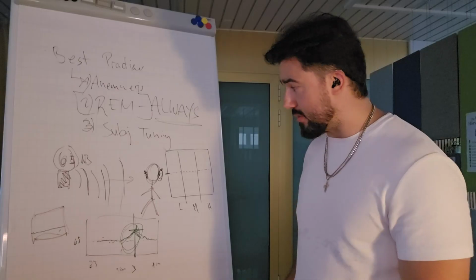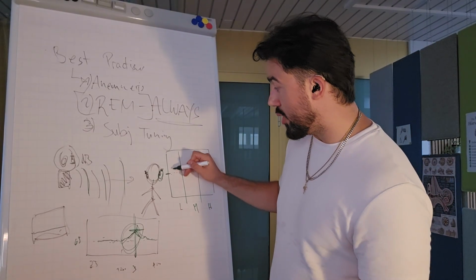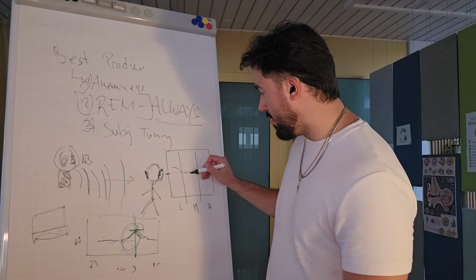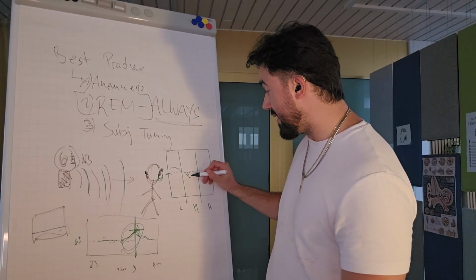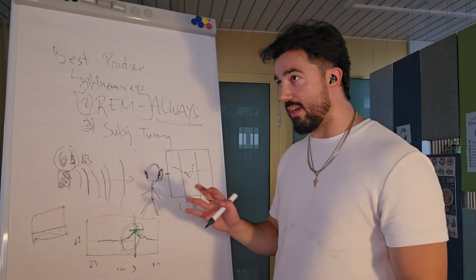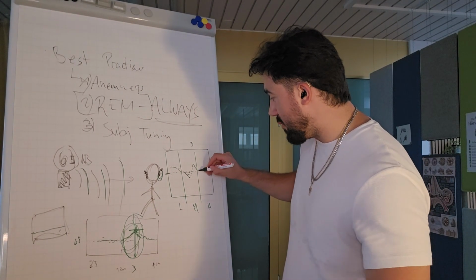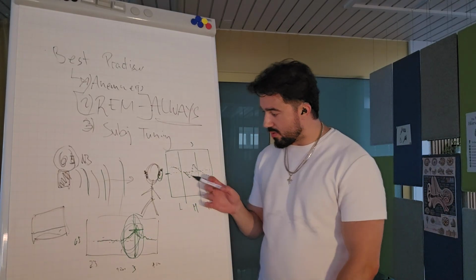We get resonances. So what could happen is that maybe you get too much of the low frequencies. Then too little of some middle frequencies, but then also too much of some middle frequencies, because around here it might be 3000 hertz, remember? And then it goes down again, and then you get this. Point is, what do you do with this now?